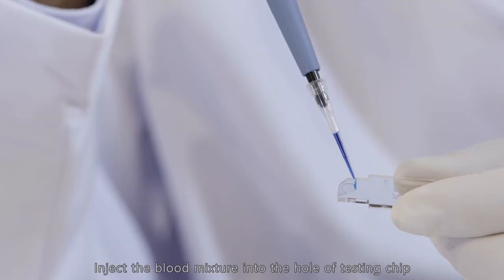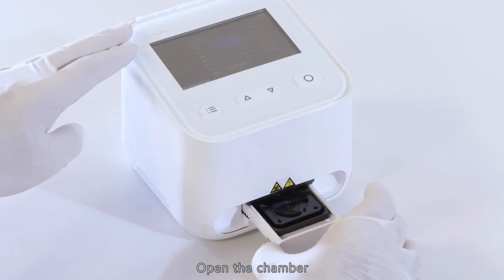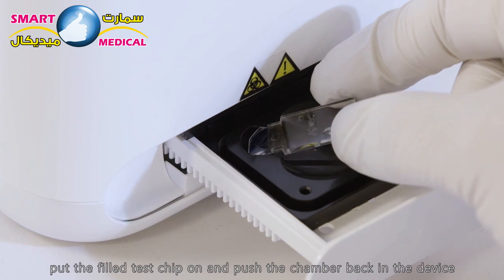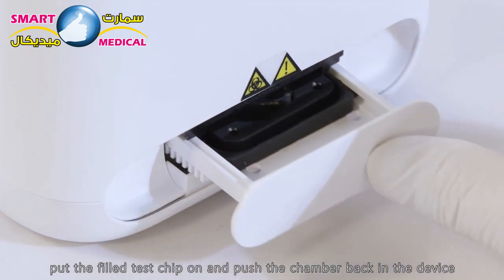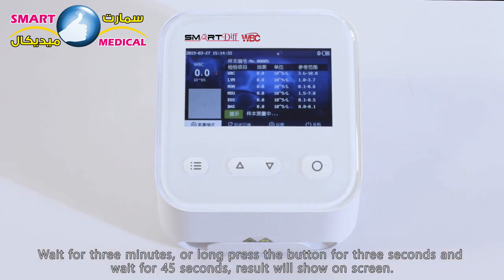Inject the blood mixture into the hole of the testing chip. Open the chamber, put the filled test chip in, and push the chamber back into the device. Wait for three minutes, or long-press the button for three seconds and wait 45 seconds. The result will be shown on screen.